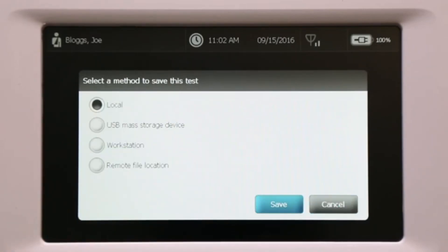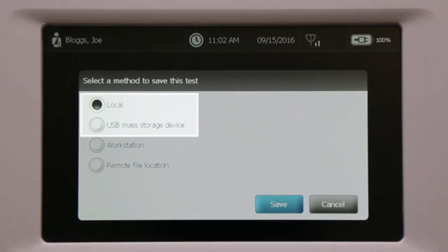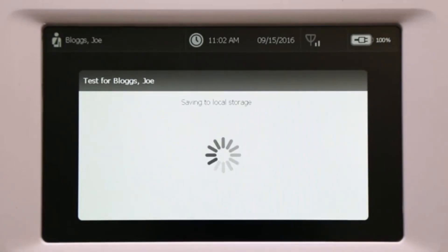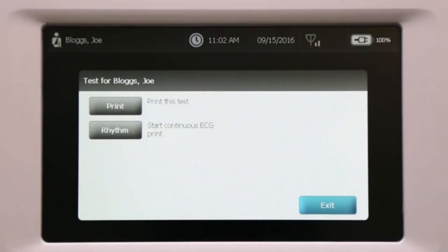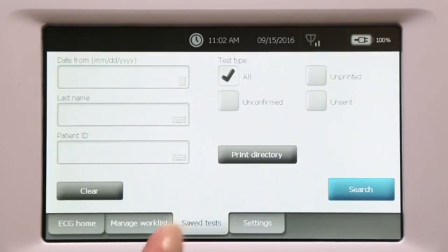Now you will be prompted to save the test. The CP150 offers multiple options for saving; however, in a non-connected environment, the most relevant choices will be local memory on the device or PDF to a USB drive. After the test has been saved, a message appears in the message bar at the top to confirm the test has been saved.